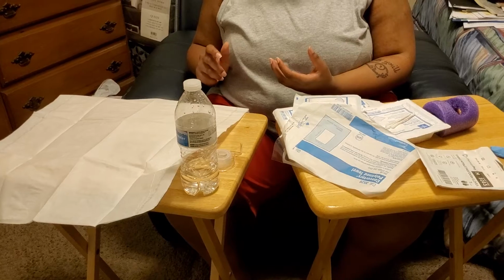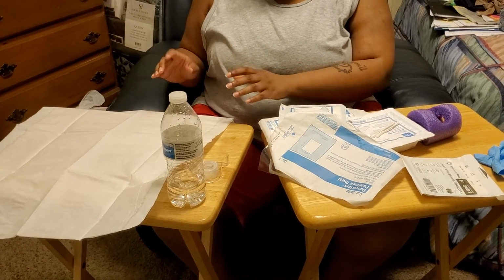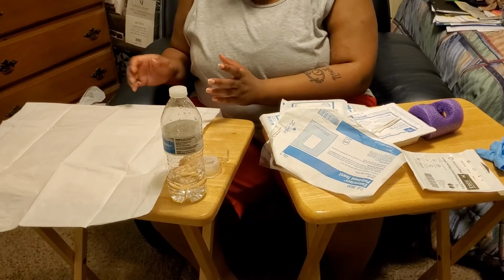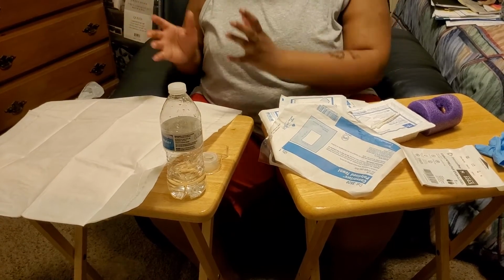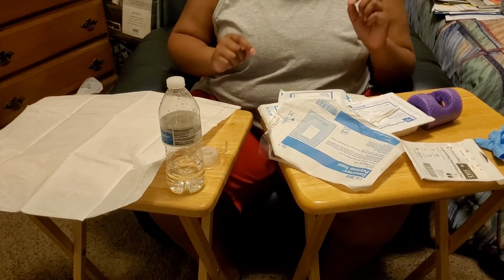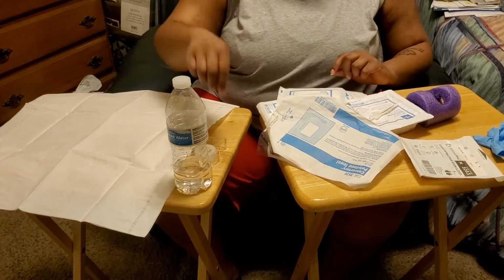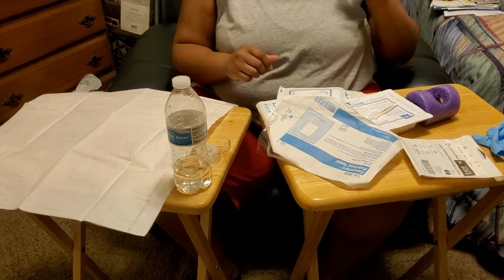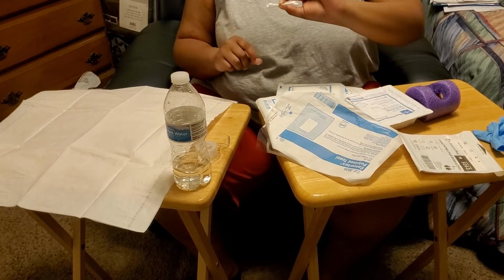To keep the area sterile, I would make sure that I don't turn away from the sterile area, and that I'm keeping my hands above the table and things of that matter. I also have my normal saline as well as tape. Alrighty, next thing I would do is open my sterile package for Q-tips.